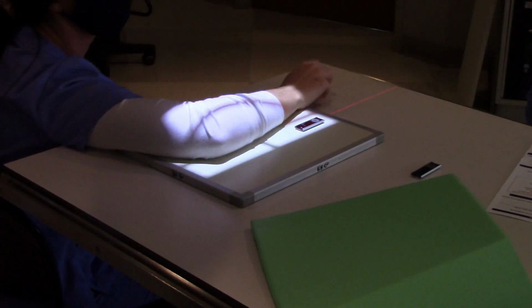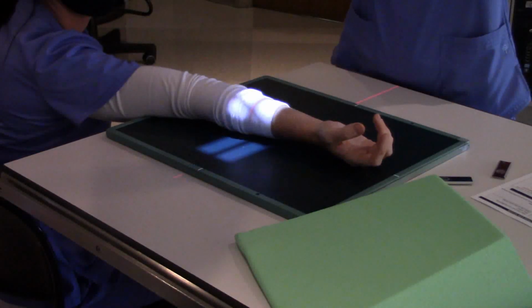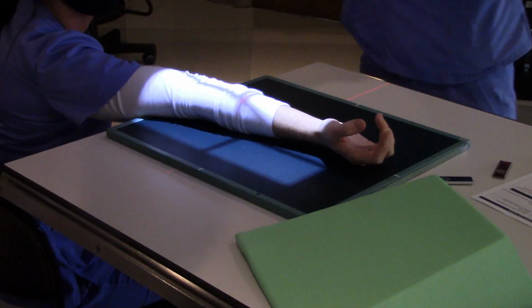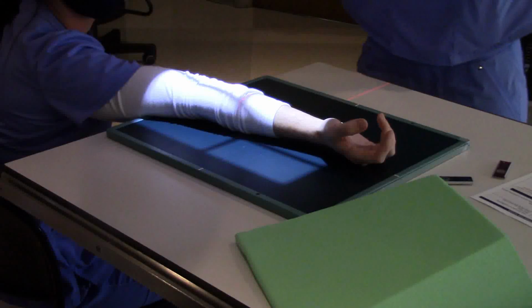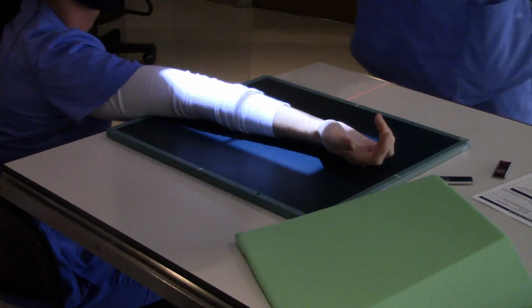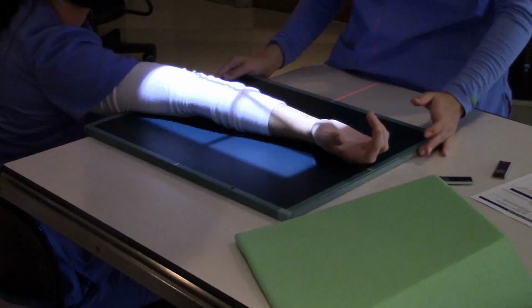Now we're on to elbow. It is. Okay, during our commercial break, I gave the patient some growth hormone. Now her arm is really long. Not a problem though, because we have some bigger image receptors. The student is locked in one-to-one combat with the X-ray tube. Mano a mano.